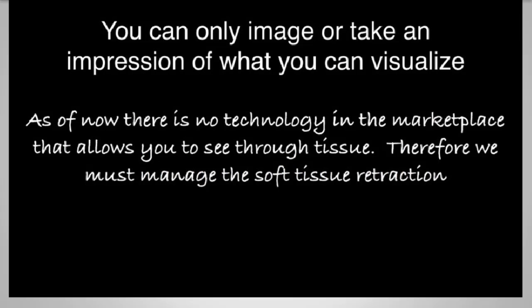Now, you can only image or take an impression of what you can visualize. It's really important to think about this. As of now, there's no technology in the marketplace that allows you to see through tissue without exposing the patient to radiation. So today, from a digital impressioning standpoint, there's no technology, digital or traditional, that can see through tissue. Therefore, we must manage soft tissue retraction. Soft tissue retraction is really the key to proper impressioning.